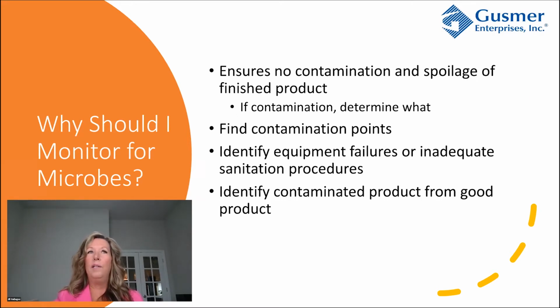So why do we want to monitor for microbes? We want to ensure that there are no contaminations in the finished product, and if there are, we would like to know what organisms they are.